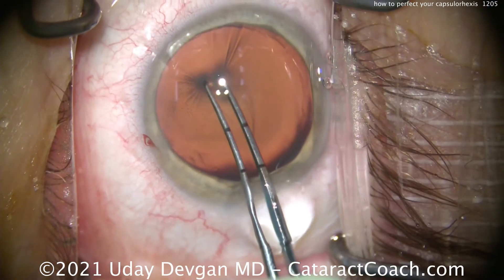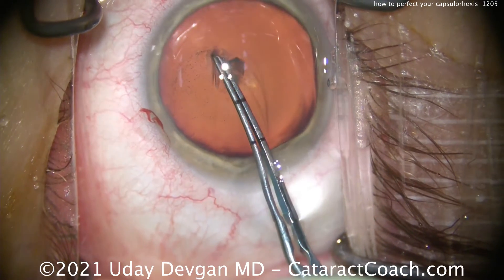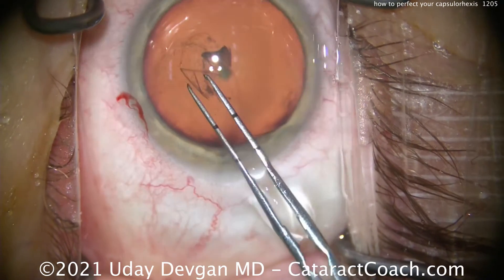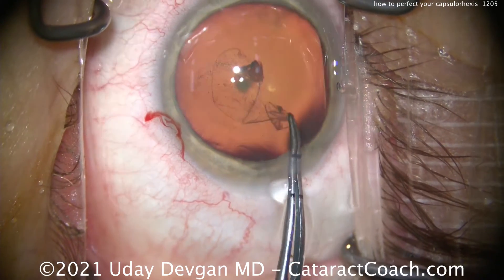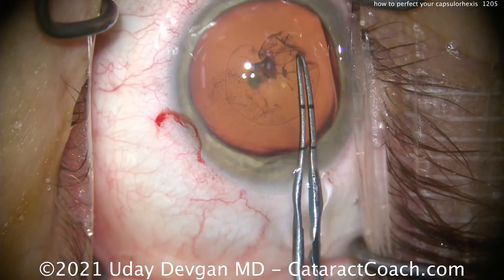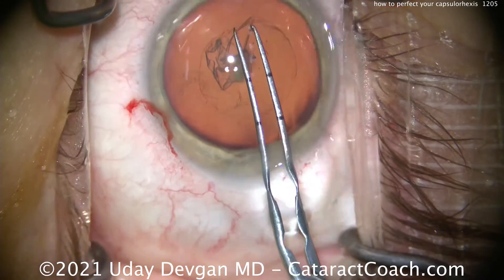We're going to poke into the lens with our forceps. You can see a little bit of zonular laxity and the capsule being a little bit on the looser side. But we get in there and we start our rexis and we spiral it out to the size we want. I'm measuring there, getting a good mental picture in my head of how big this rexis should be. This is a younger patient and I've got to make sure that I have a beautiful capsulorrhexis here, so I continue it, keep going, and we'll bring it around.